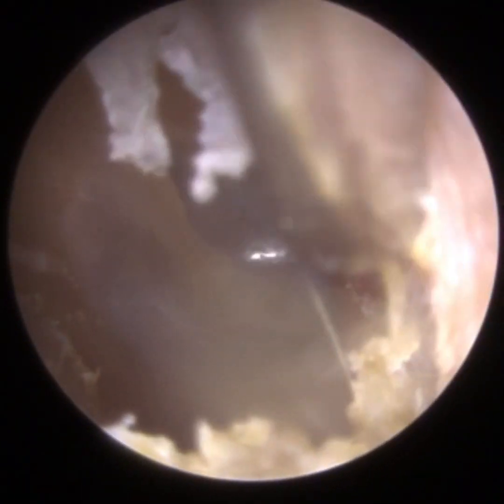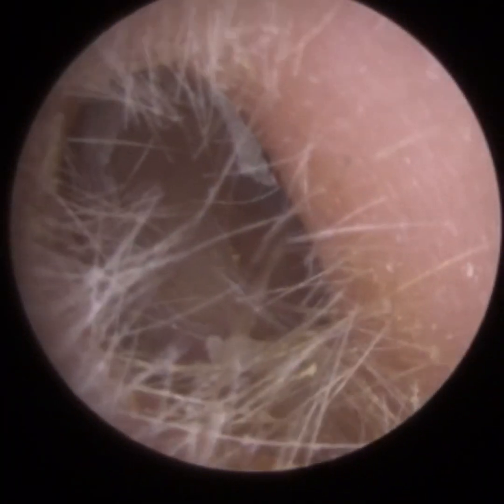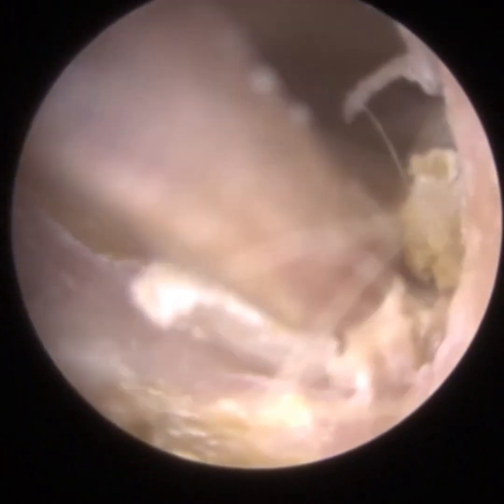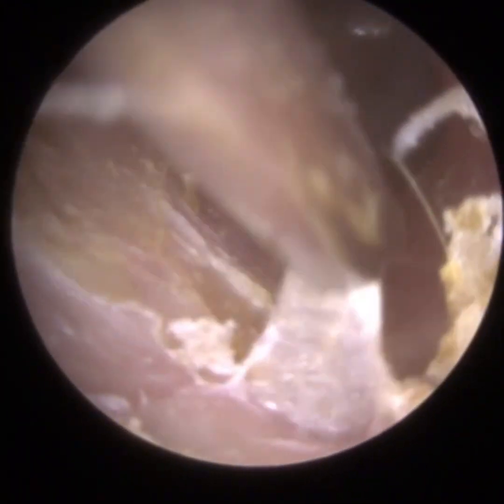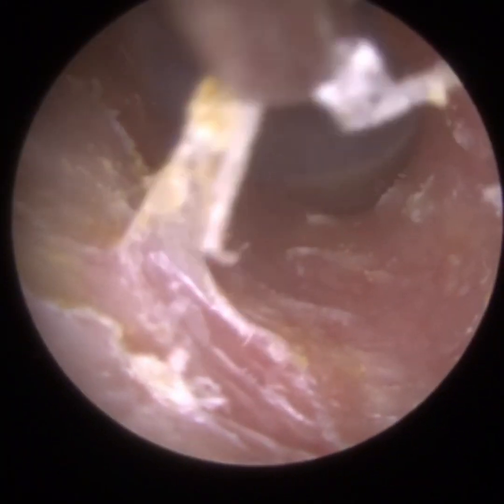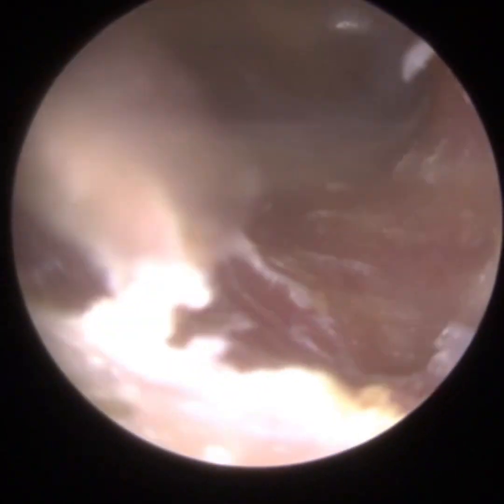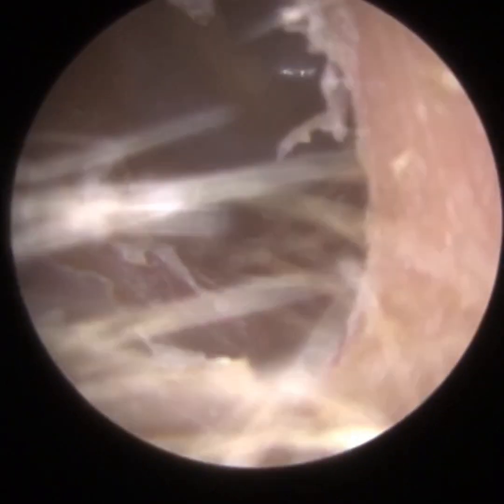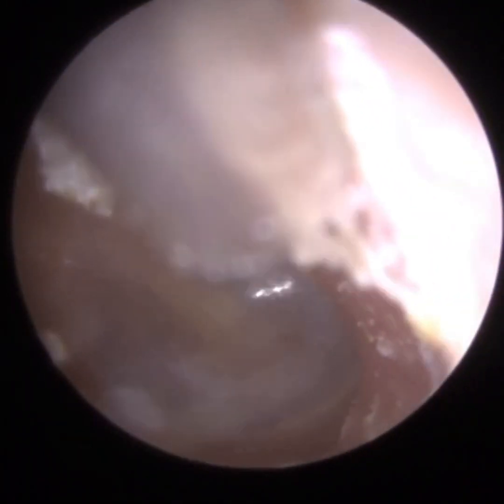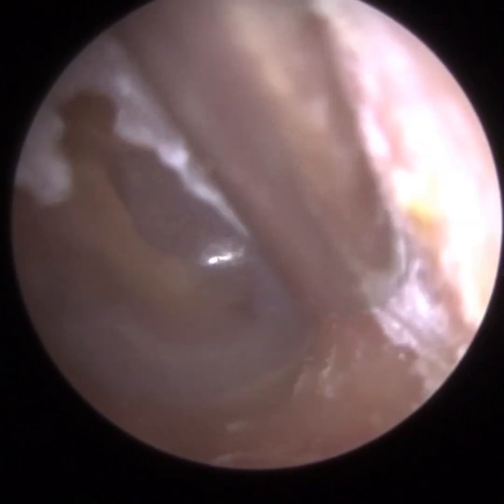You can just see the view of the eardrum here, even from this distance. The endoscope is barely in the ear — we're about two and a half to three centimetres away from the eardrum, and we can still visualise the eardrum quite well, and we can even see the light reflex. Whenever I'm peeling skin, I'm using almost brushstroke movements away from the ear canal — making contact with the dead skin and then lifting the skin away in little flakes. It's not about getting it in one flake; sometimes you just do it slowly but surely. The patient has already got some prescribed medication for their otitis externa — some acetic acid spray — which should help.